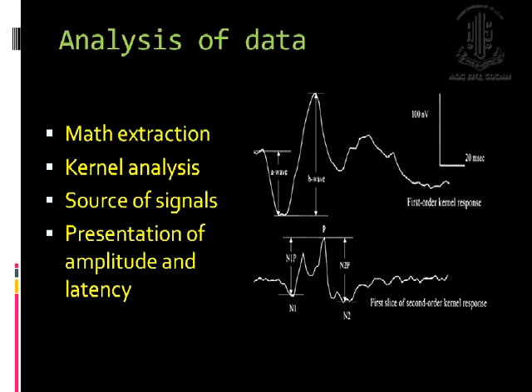When it comes to the analysis of the data, the ISCEV requirement is that this part of the signal should be present in the analysis. This part we call the first order kernel.